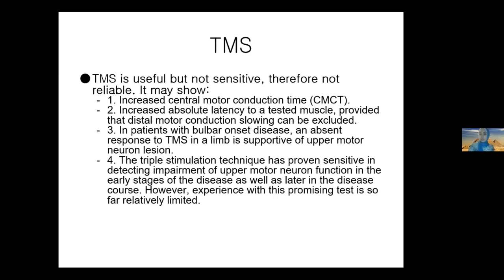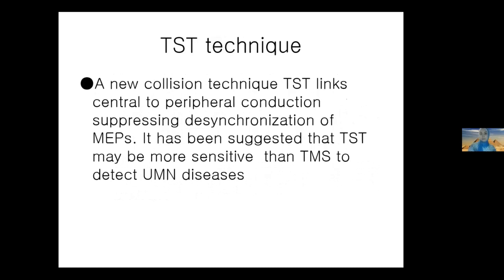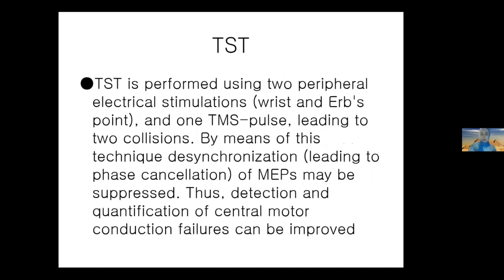To increase the synchronization of a motor unit volley. So first the one over the skull, then over the wrist to allow collision, and then the one over the roots, because this way I can really get an accurate assessment of the motor units that are still functioning. We talked about this.